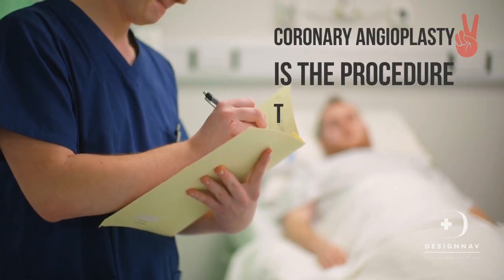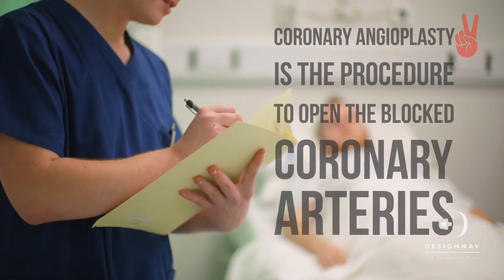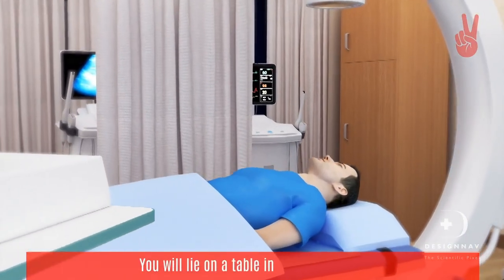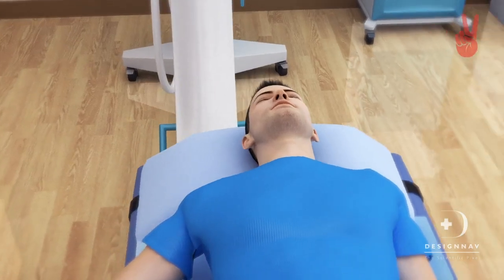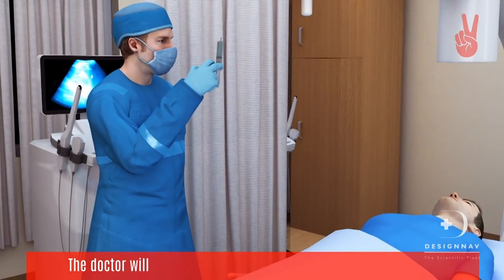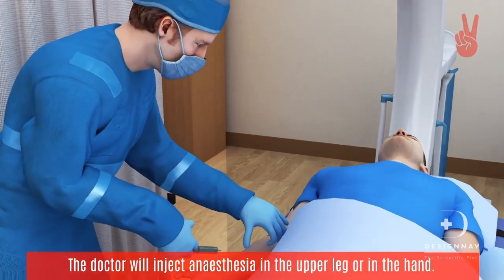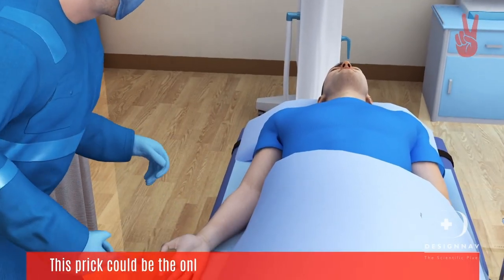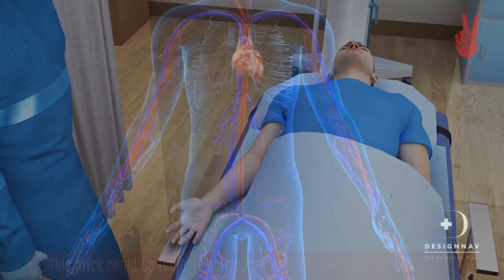Coronary angioplasty is the procedure to open the blocked coronary arteries. You will lie on a table in a special room. You will remain awake throughout the procedure. The doctor will use a small needle to inject anesthesia in the upper leg or in the hand. This makes you numb but doesn't make you sleep. This needle prick could be the only pain you will feel throughout the procedure.